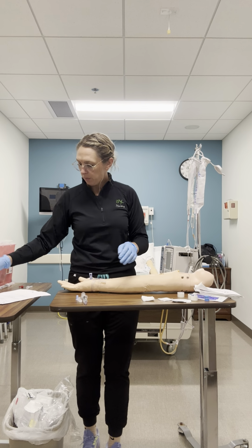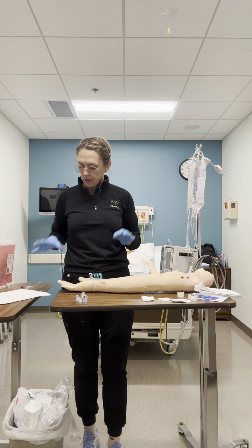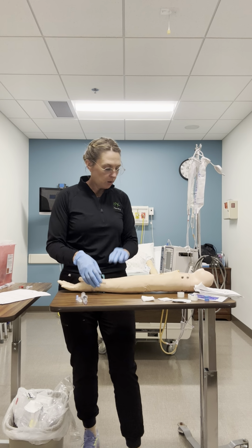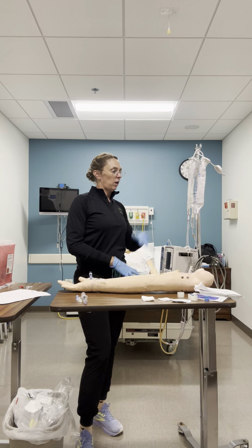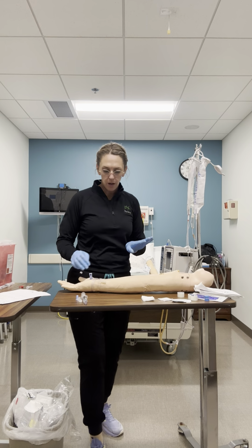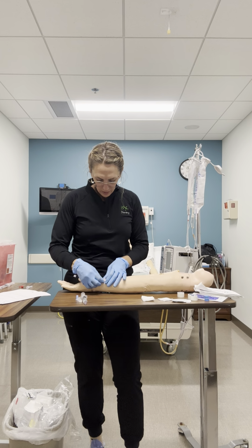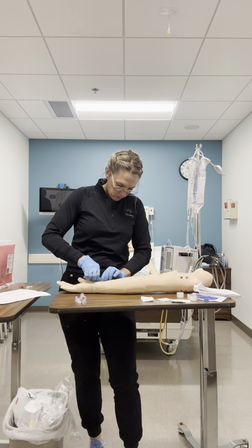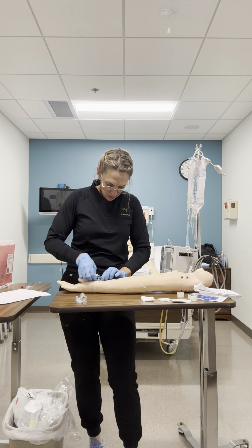I have my healthcare provider orders to disconnect the IV. So I'm going to go ahead and come in. I would turn my infusion off, make sure that the clamps are on and the pump is turned off. I would disconnect all of that. This would be also disconnected.